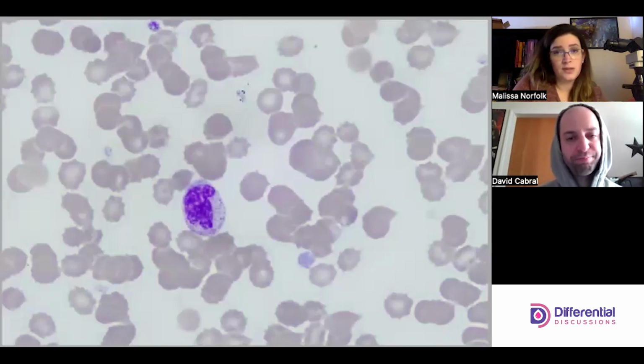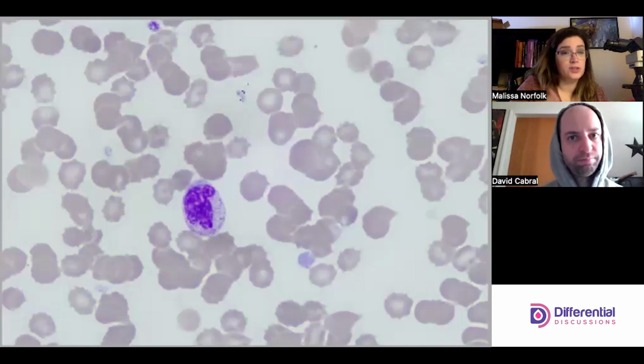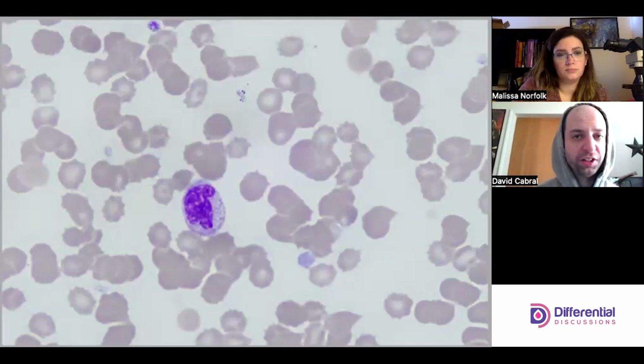So we knew there was something going on, but we may not have seen anaplasma on another slide. Reporting out what you do see helps confirm in the physician's mind that you're seeing some kind of reactive process, even if you don't see the anaplasma. We want the doctor to still be drilling down on infections that are possible.